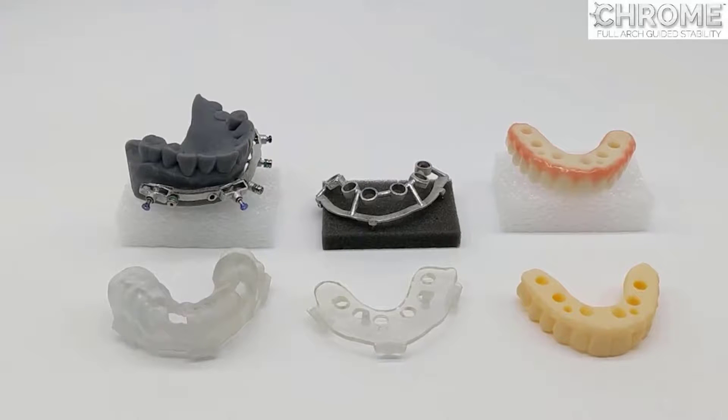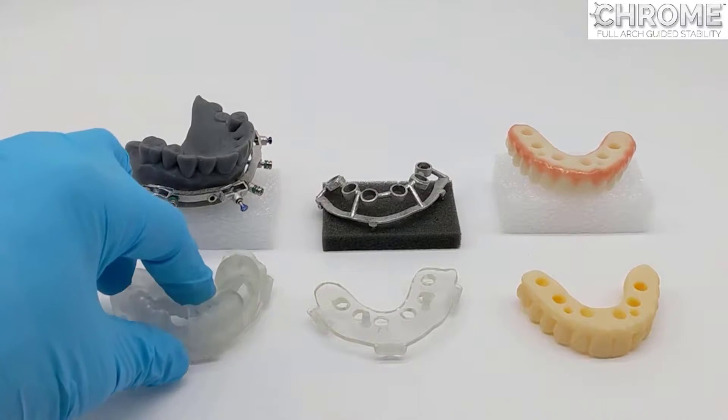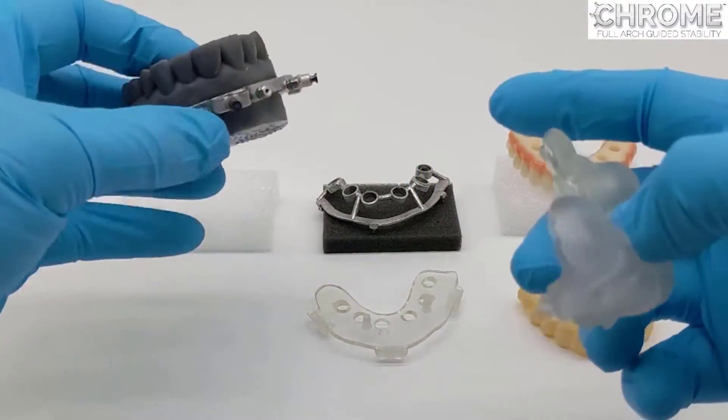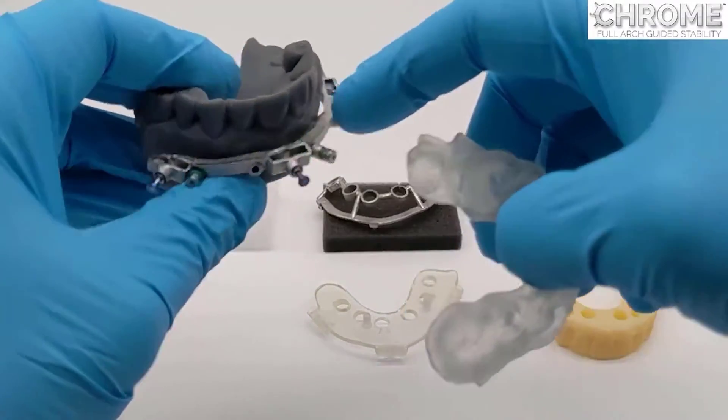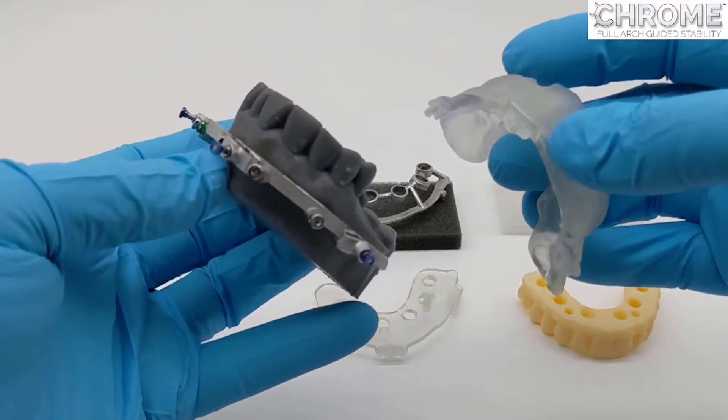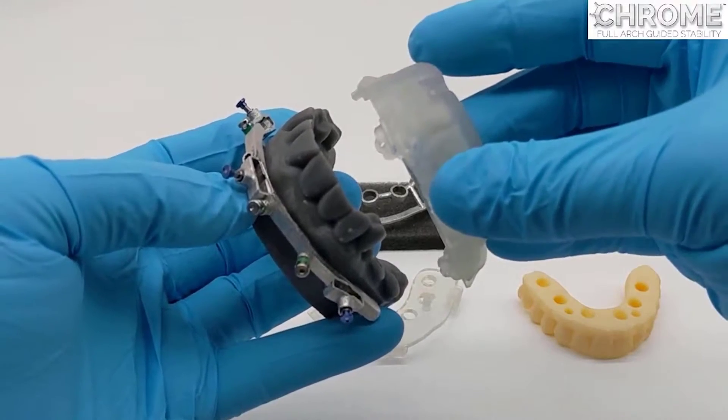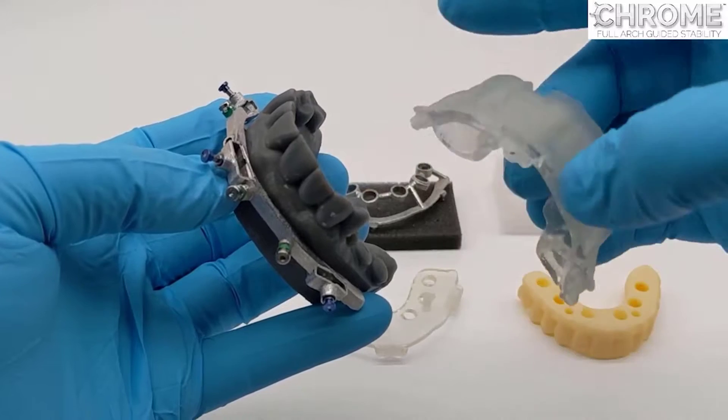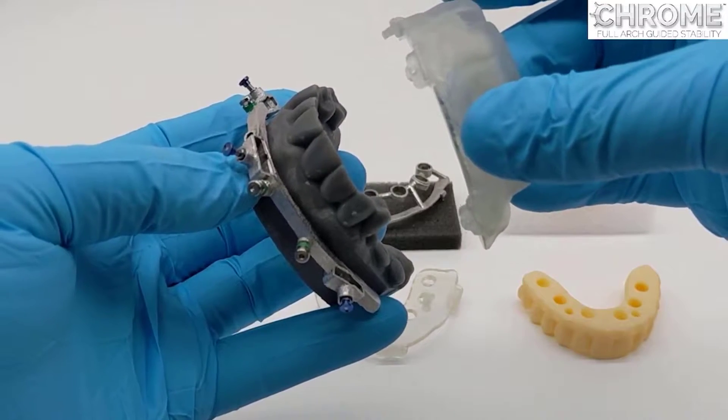The pin guide delivers the fixation base. The fixation base is the metal apparatus that is used for many functions which we will explain. The pin guide is tried in to make sure that it has no rock, that it fits on the teeth, or if it's edentulous, fits on the edentulous ridge exactly as the denture.